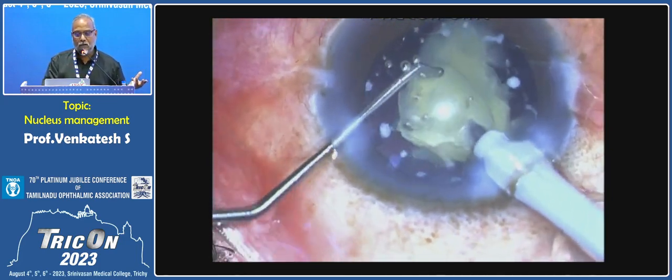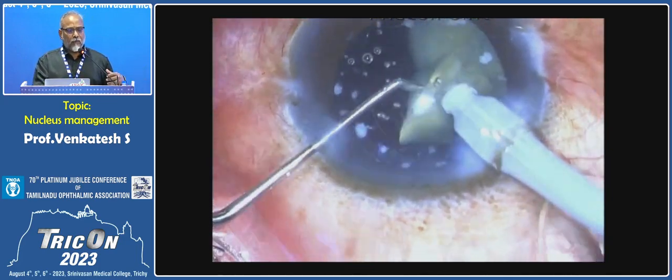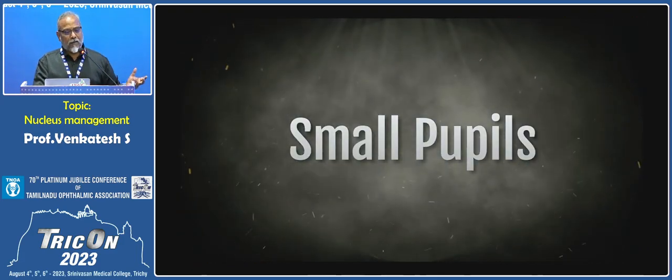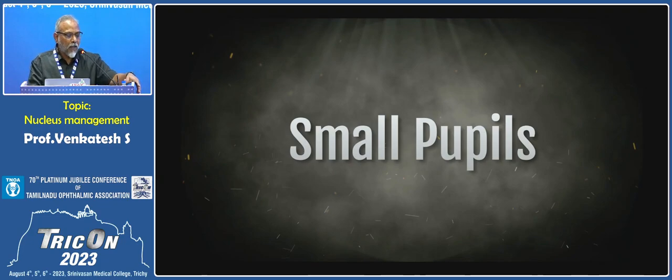With a horizontal chop, if you have different grades of cataract, you don't want to push the instrument to the periphery in order to create the chop. So especially in Morgagnian cataract, a horizontal chop is much better. I've finished my time and my talk too. I just wanted to show you small pupils where direct chop works well, and you've already seen the direct chop. Thank you very much for your attention.